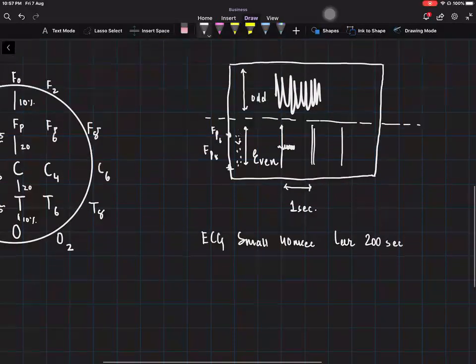Similarly, the gap between each vertical line represents, I think, either 0.5 seconds or 1 second. Does anyone remember whether the gap is 0.5 seconds or 1 second? Most likely it is 1 second, but I'll correct myself in the group if I'm wrong by any chance.